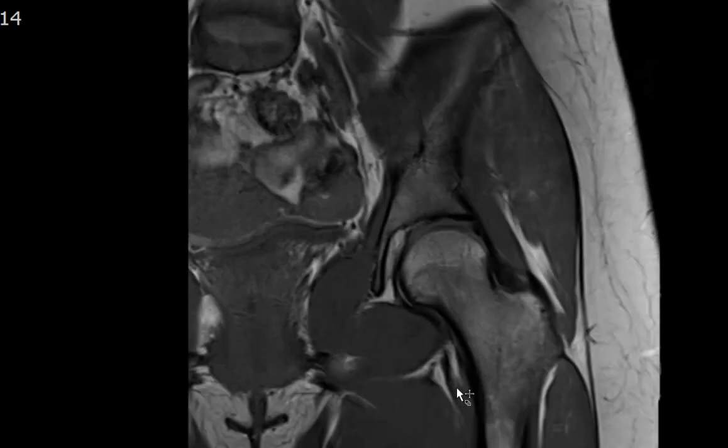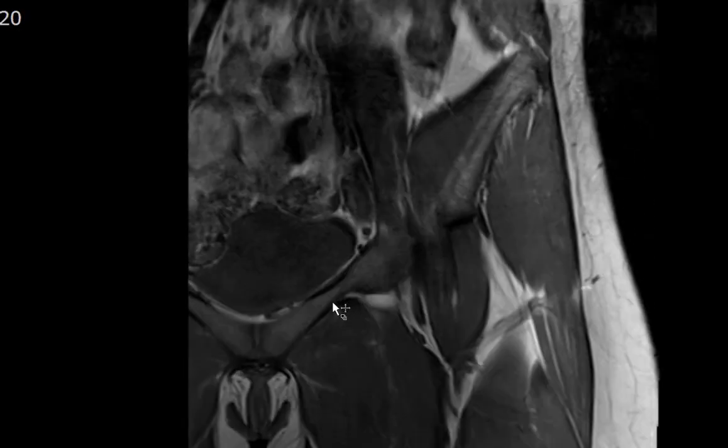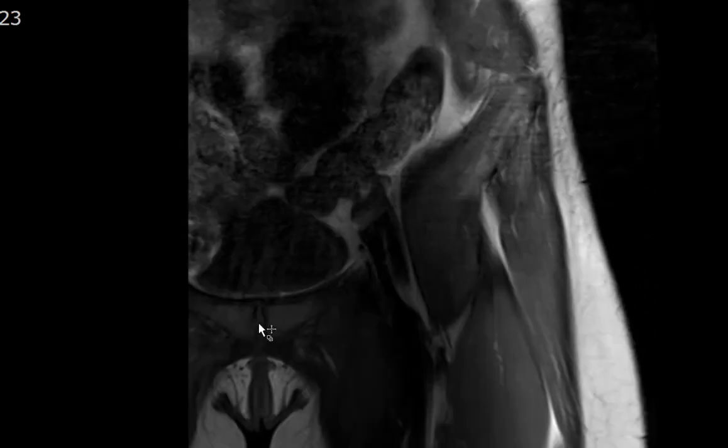This is the greater trochanter, the lesser trochanter, the femoral head, femoral neck, and femoral shaft. This here is the ischial tuberosity, the acetabulum, the superior pubic ramus, the pubic symphysis, and the sacroiliac joint.